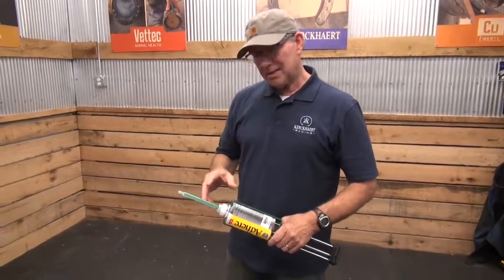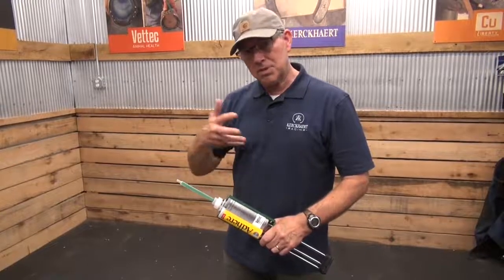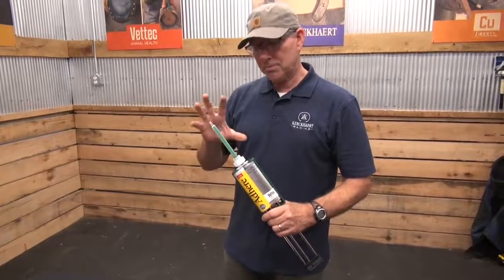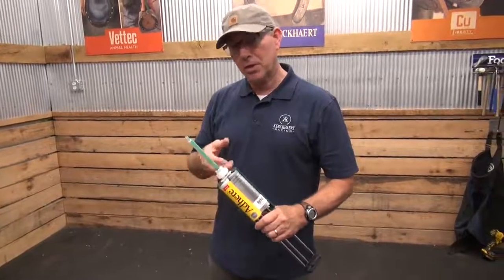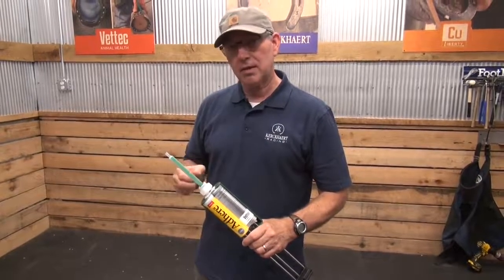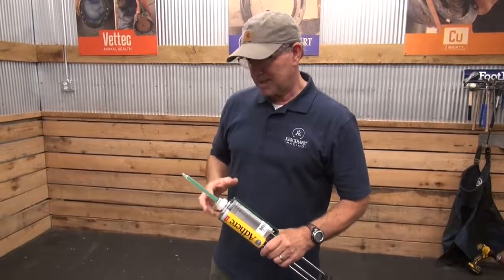And one of the things that I didn't mention that is different about urethanes is because they're so fast setting, you can't dispense material out and then spread it around. You really don't have time. So all of your application control comes from this system. And so this is the system that we need to use. With acrylics, we can spread materials around, because of that longer set time, you've got the time to do that. With these, it's very quick. Just like I said, is a real benefit when you're trying to get something done quickly.